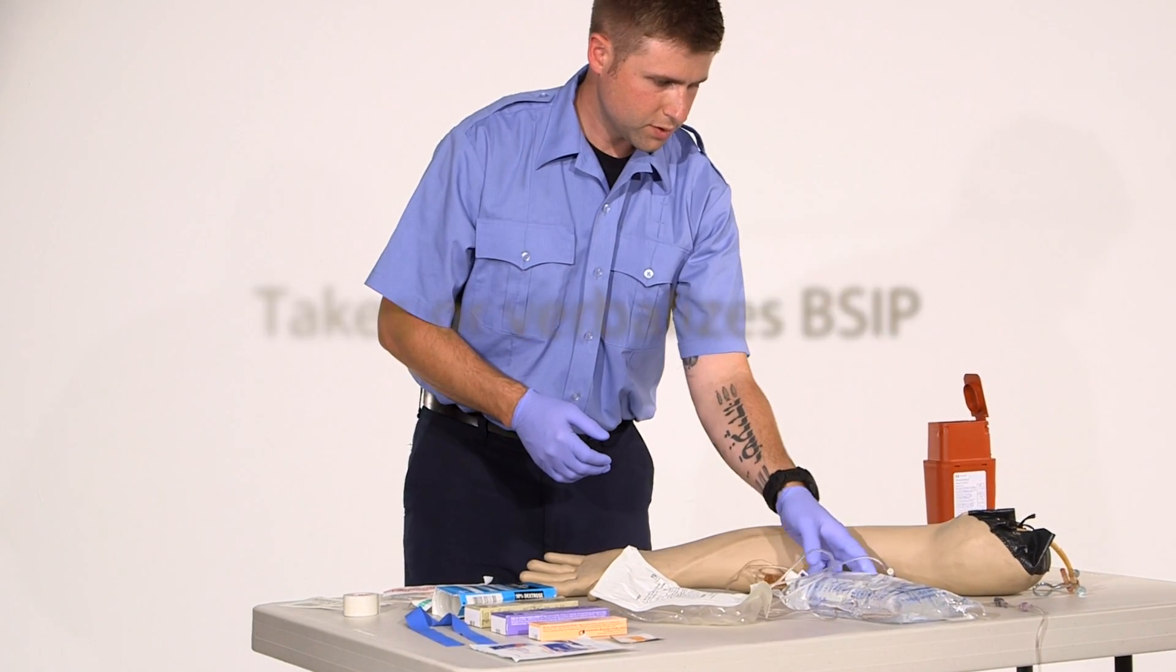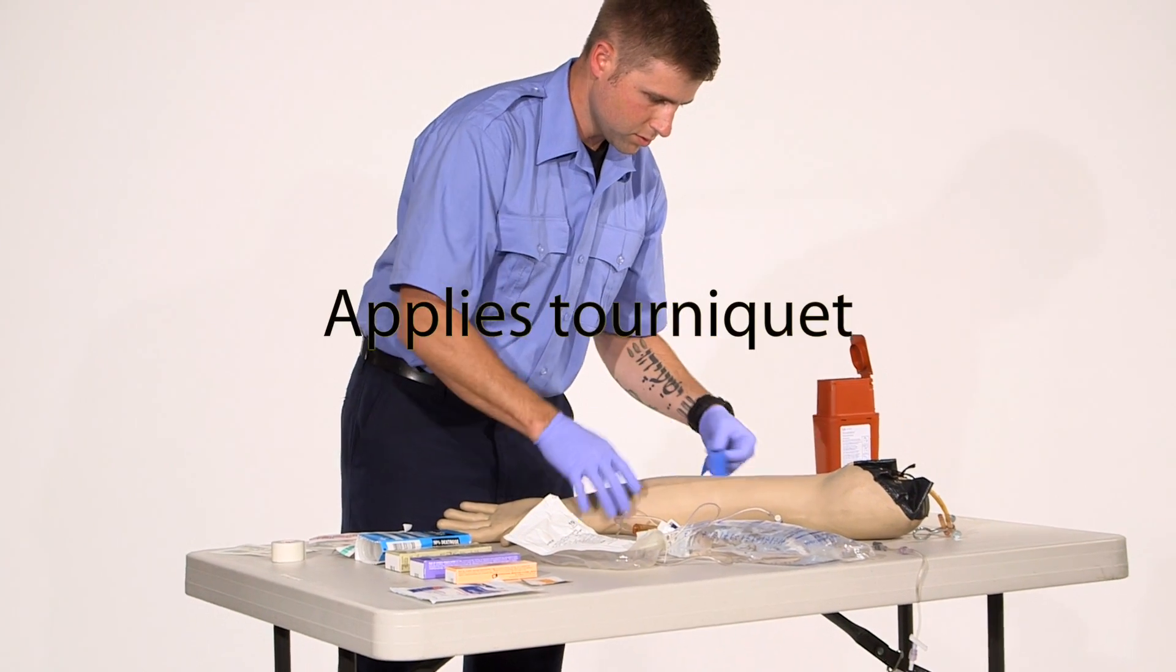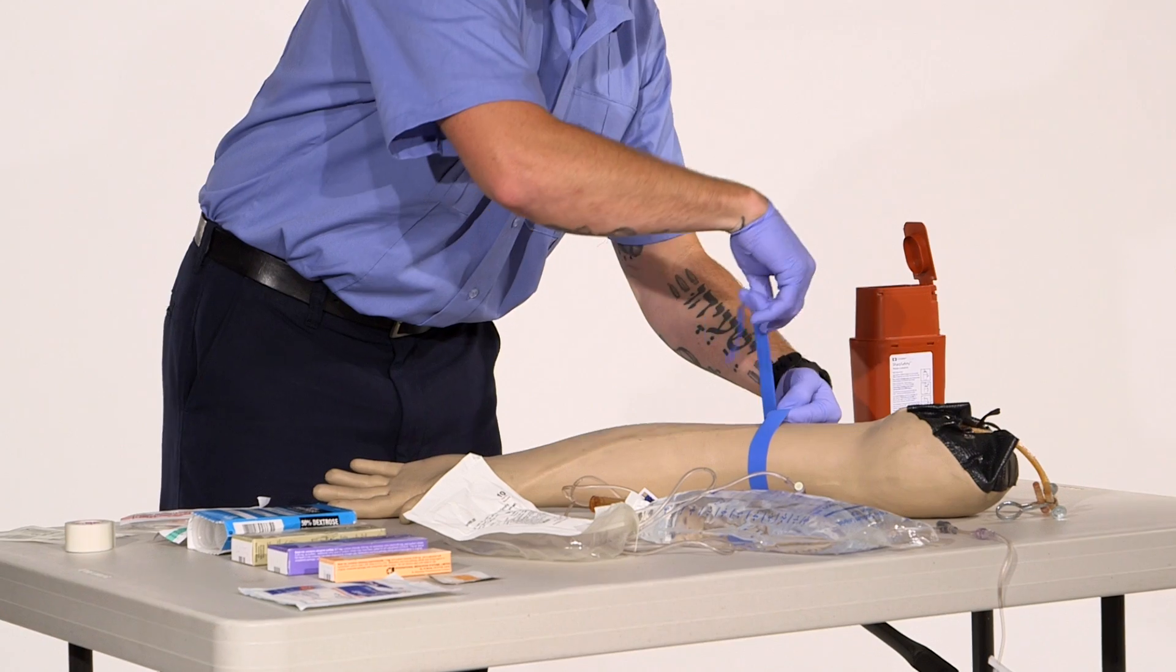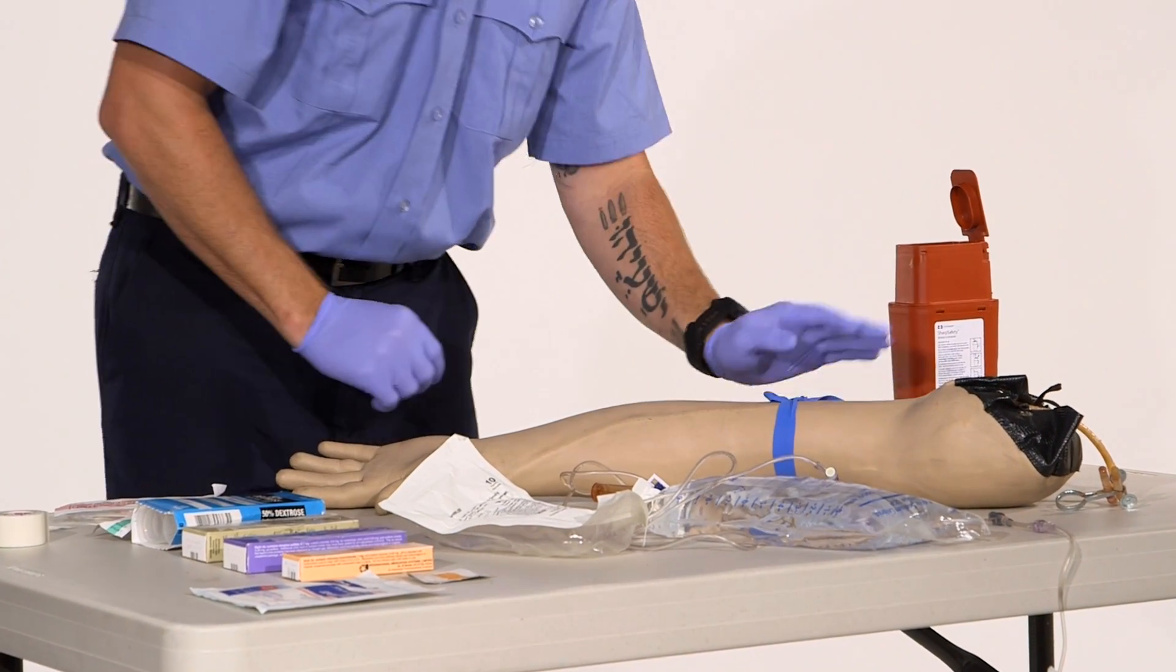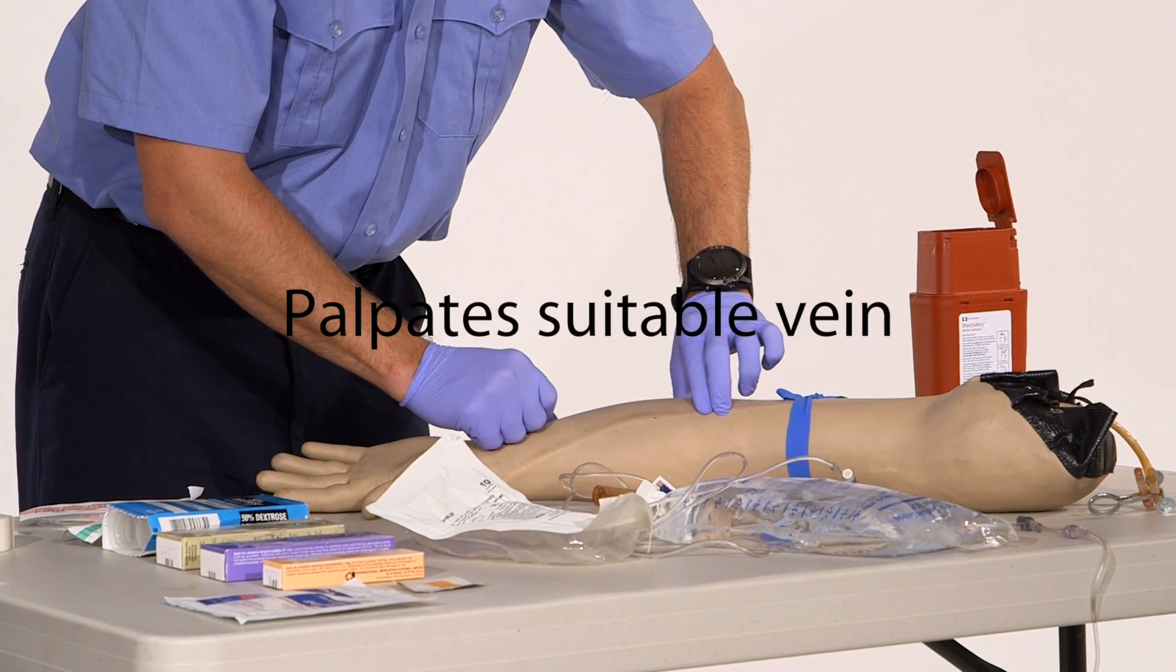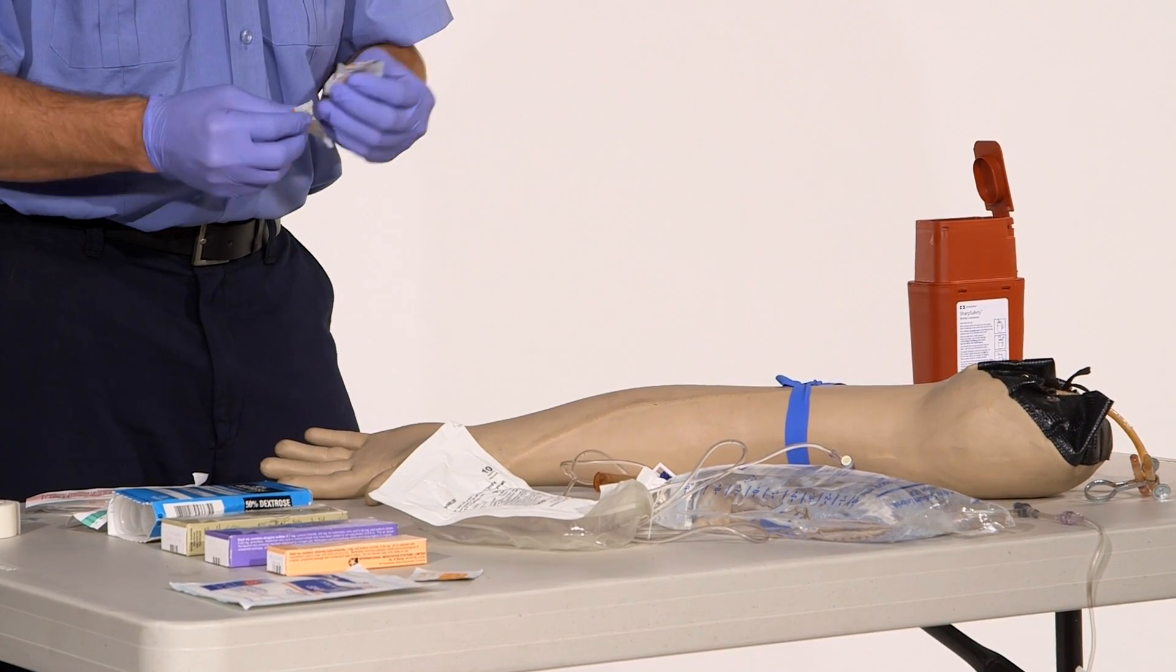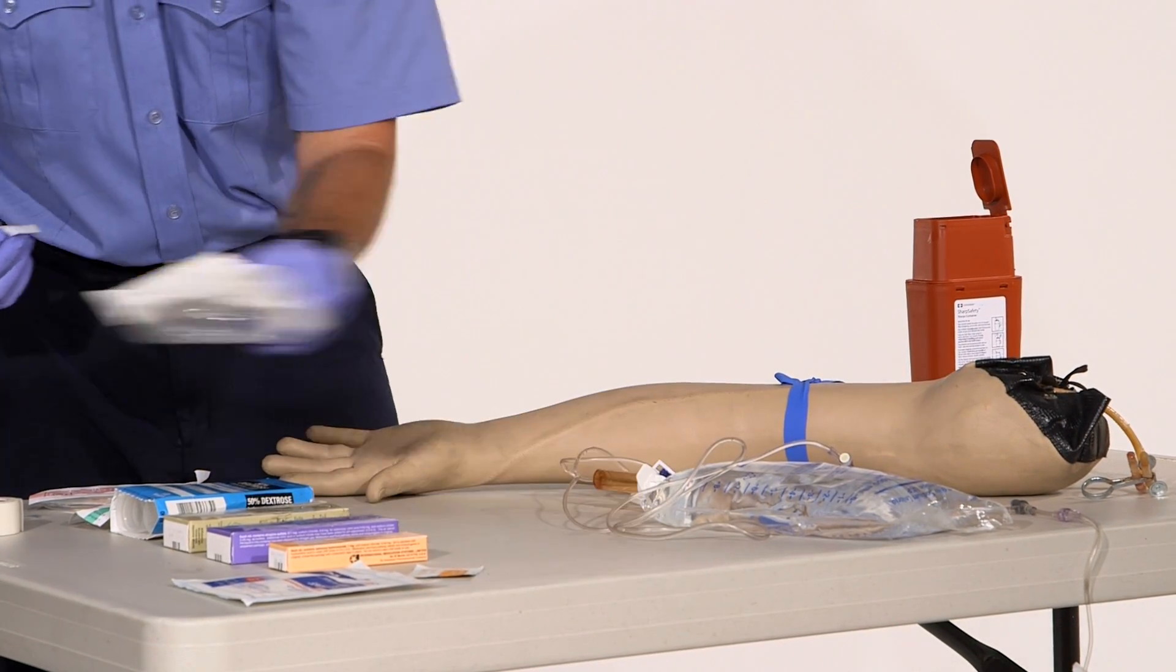All right, I want to select a vein, so I'm going to place a tourniquet in my arm. I got my tourniquet placed, I'm going to palpate a vein, find a correct site for a catheter. All right, got a good vein there.